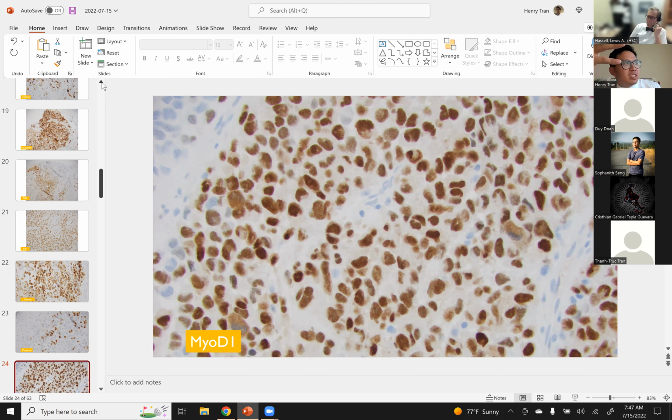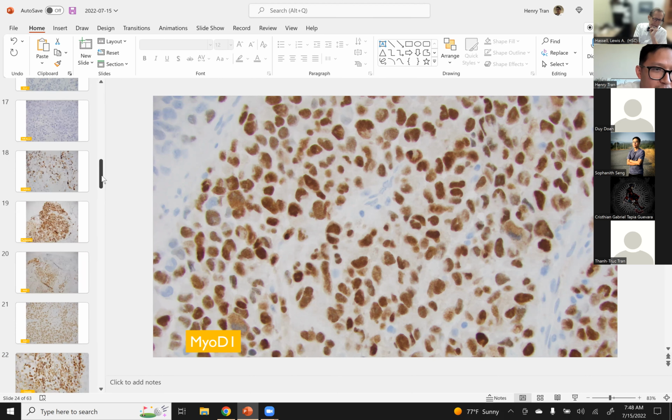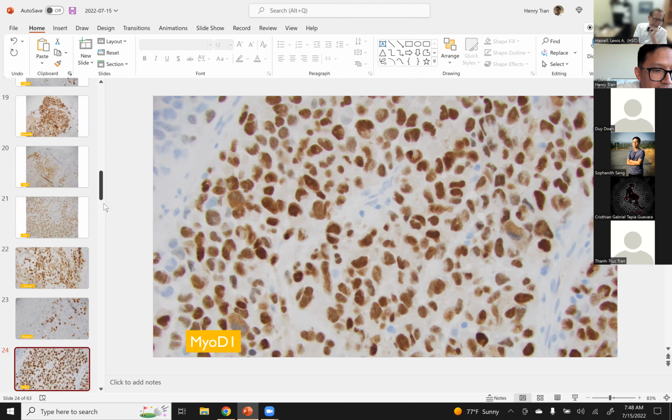Going back to my example of the AFH, since they did an EWSR1 and that showed an abnormality, I thought, well, why not? Let's try FUS. See what that shows. And what ended up happening, it turned out that FUS was positive for translocation. So we do have a FUS translocated tumor. But what is it now? Has someone described anything like this before? So I looked it up.